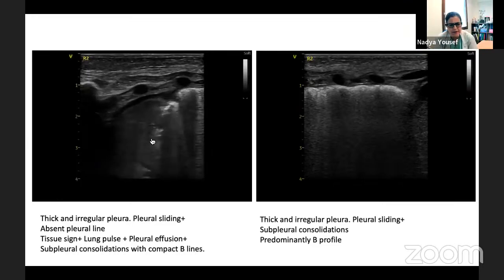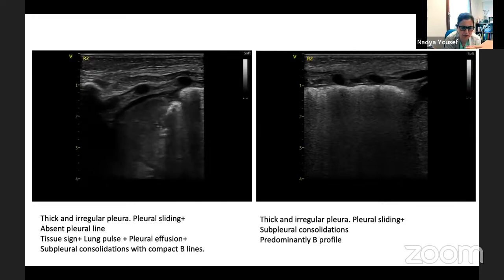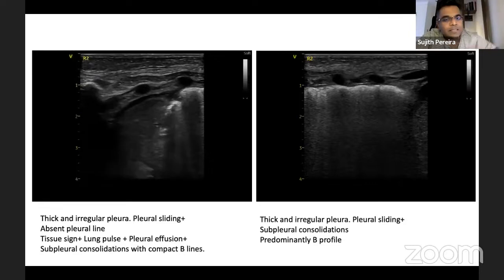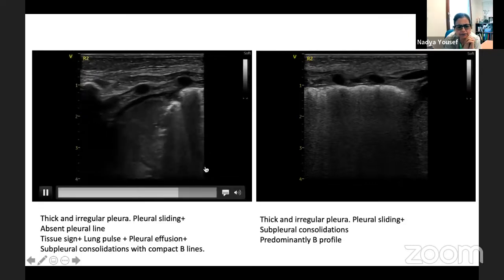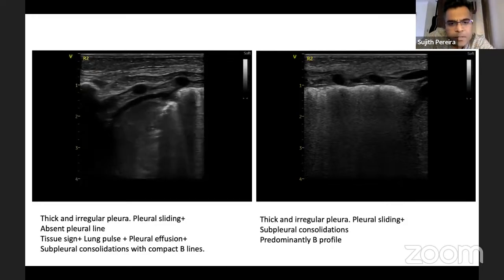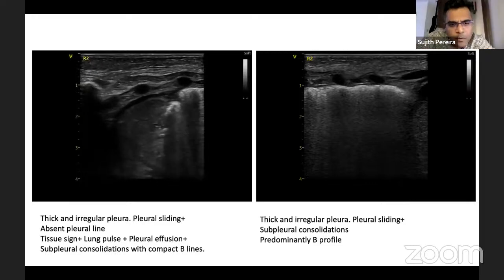Going back to your scans, I think I have a little bit of a problem. They're a bit dark on my screen, so maybe they might not be the same with yours. But it's an interesting image. Is this something that later resolved, the one that you said was R1 but you've labeled R2? Sorry, this is mislabeled. It is actually R1. There has always been a right upper lobe dense collapse that this baby's had, at least on the X-rays that you're seeing. There's always this persistent collapse on the right upper zone.